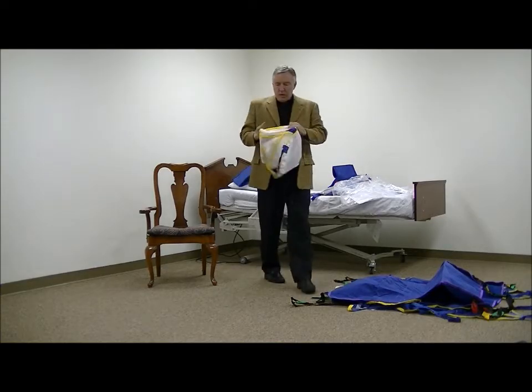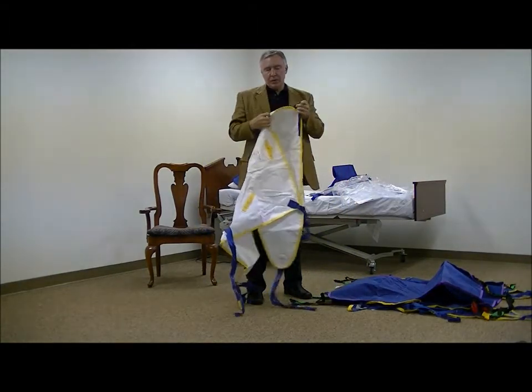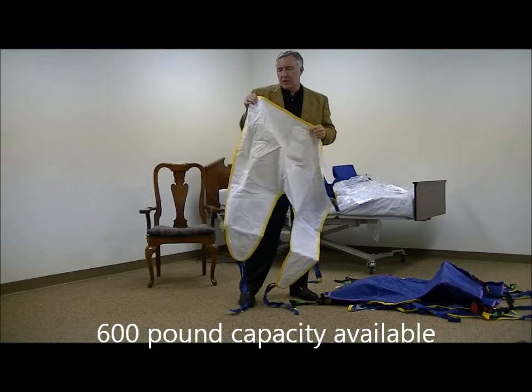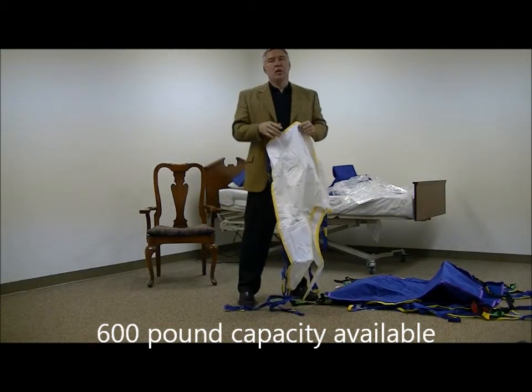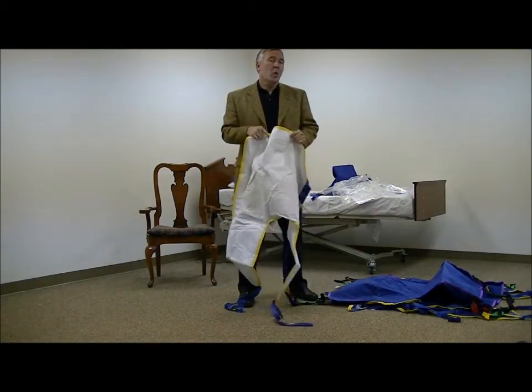Now I'm going to show you a sling that looks quite different than the others in the white material. And it's actually a non-woven material because this is what we call a patient-specific sling. This is becoming very popular in the industry because of the importance of infection control and the difficulty of managing laundry.